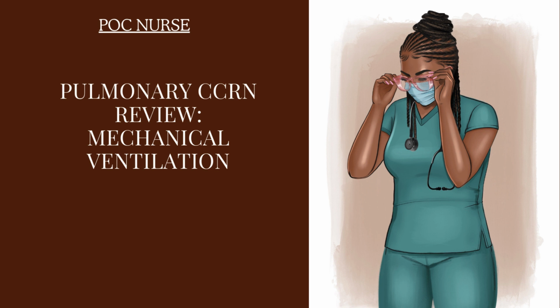Now let's talk about CPAP. CPAP is continuous positive airway pressure. CPAP is PEEP that's applied to a patient that's breathing on their own. So the patient does not get any breaths from the machine. The patient does all the work of breathing by themselves, and usually you can use CPAP to wean a patient off the ventilator. The breaths that the patient is breathing on their own could be pressure supported by the ventilator.